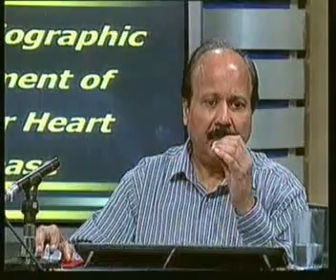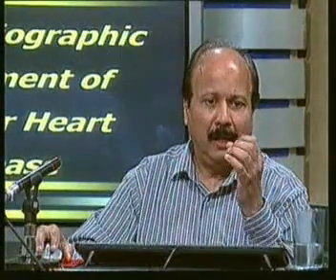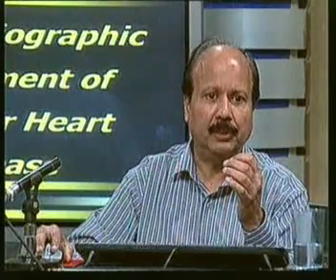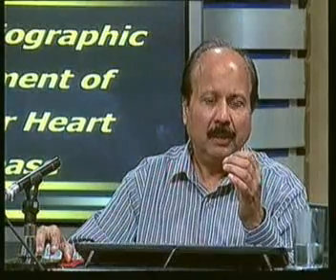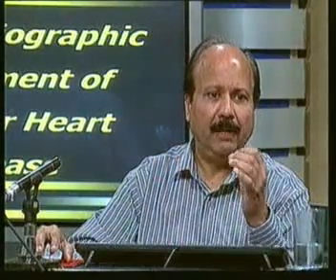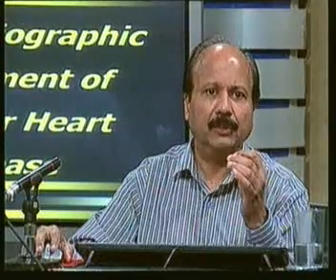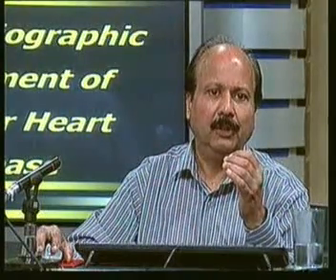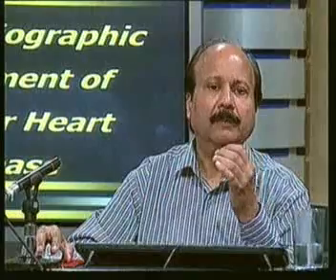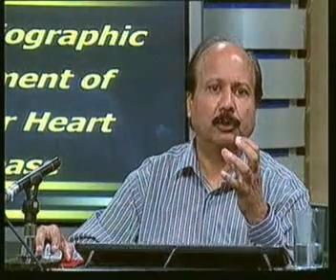So from an investigation which was 20 years ago an ancillary procedure, now echocardiography in valvular heart disease is a definitive procedure. No surgeon will ever touch a patient of mitral valve disease until and unless he has gone through extensively transthoracic, transesophageal and 3D pictures to find out what he will do with this patient. Will he repair it? Will he replace it? And if he replaces it, what size of prosthesis will he require?